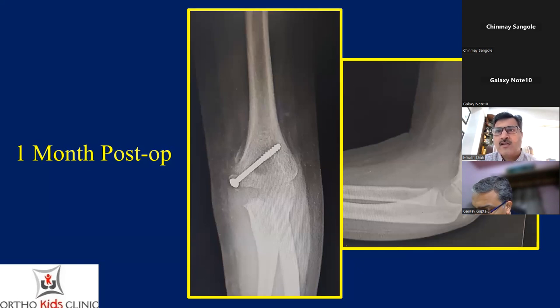So that is an external oblique view? No, sir. The axial view is like what we take for the shoulder; they similarly took it for the distal humerus. Okay, so share that paper. That will be of great help.